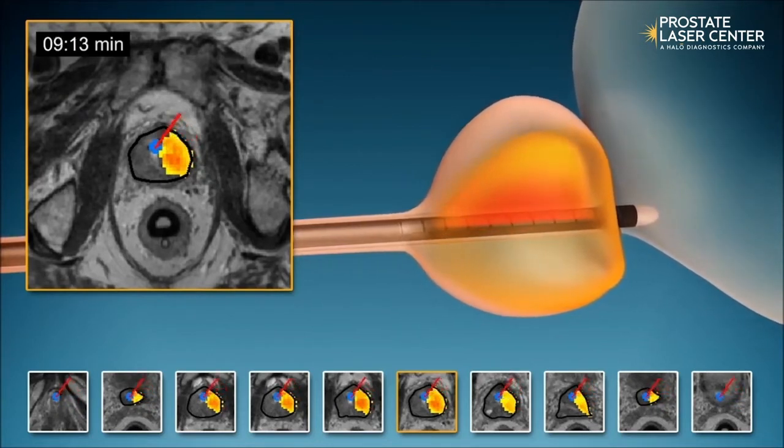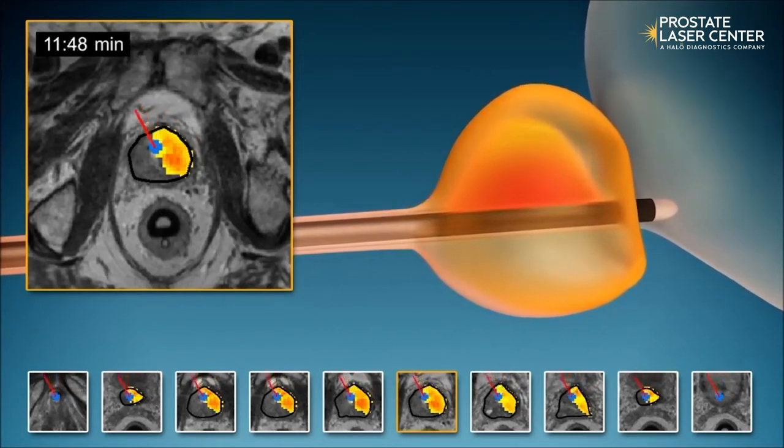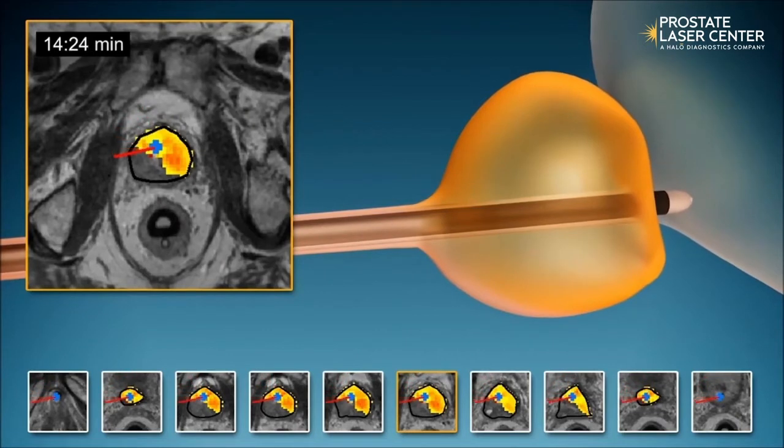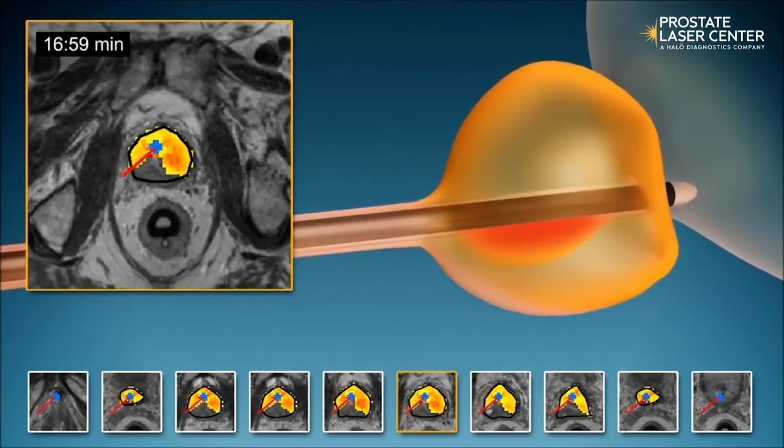These areas of tissue may have cancer, or just be excess tissue due to an enlarged prostate making it difficult to urinate, or both. Ablation zones are programmed into the Tulsa system ahead of time and can be personalized to each patient's situation.